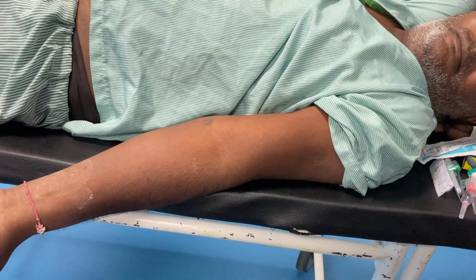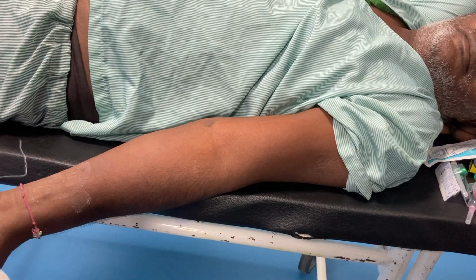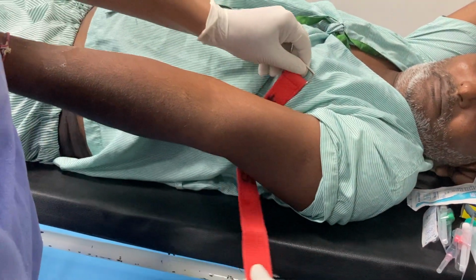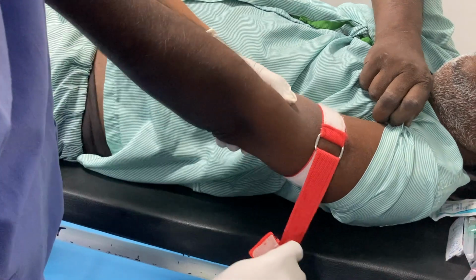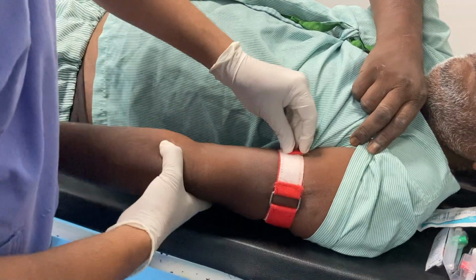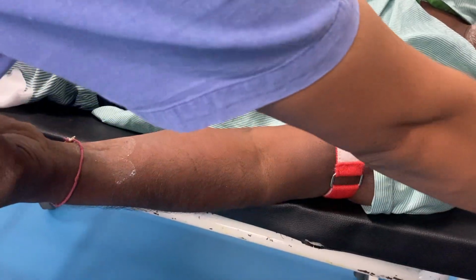Okay, now in this patient we are going to perform the USG guided IV cannulation. So first we have to apply the tourniquet. So I have applied the tourniquet, and next step is aseptic precautions.